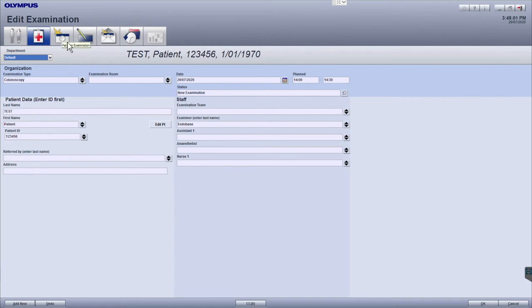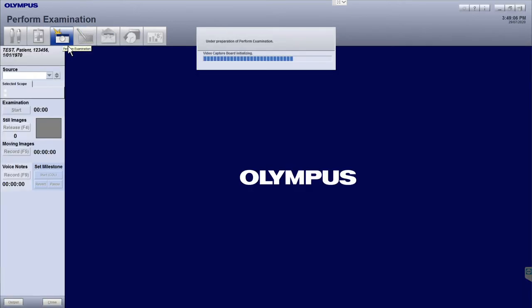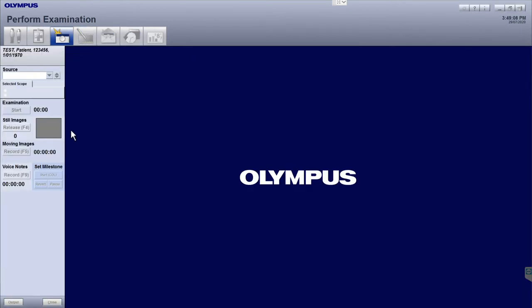The camera flash icon is the perform examination module. This will allow you to capture procedural images into Endobase from your processor. You will also be able to capture procedural milestones here.